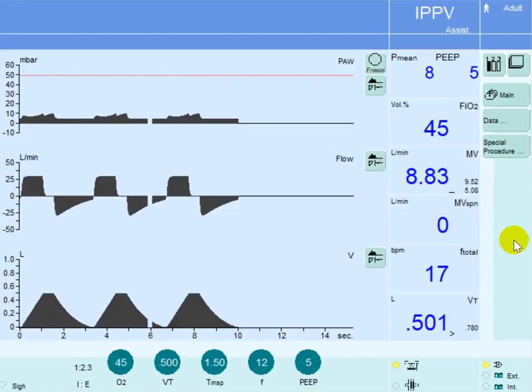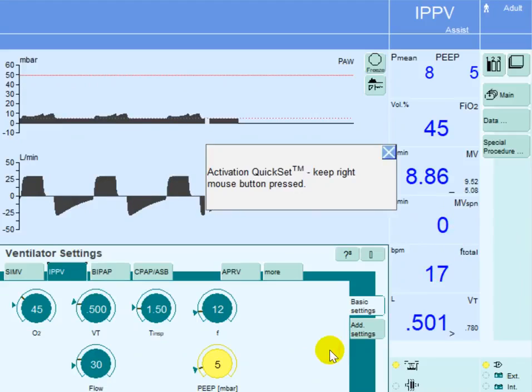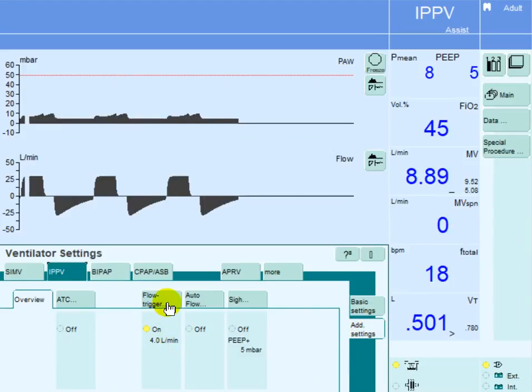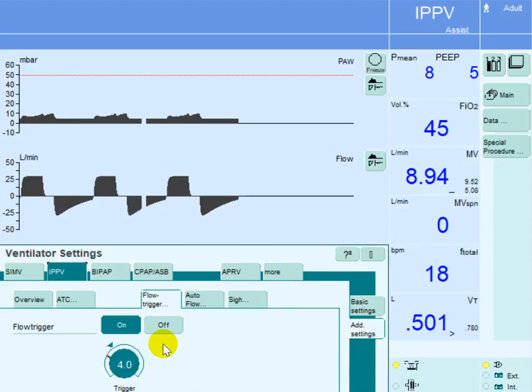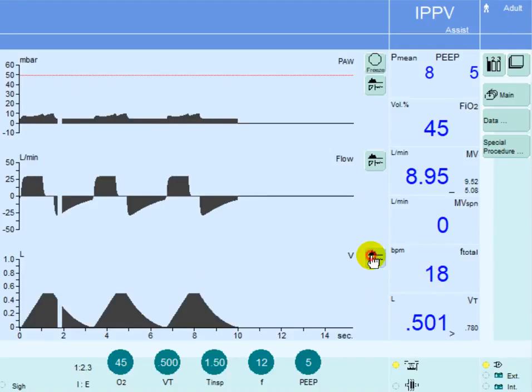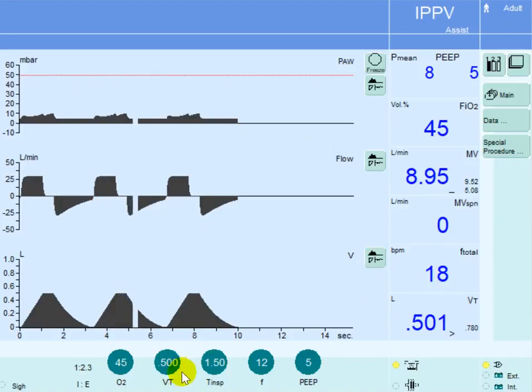In order to trigger the ventilator, the patient has to reach a flow trigger level, which is set here at four liters per minute. So the patient has to initiate a flow of four liters per minute before the machine is triggered and delivers the tidal volume.